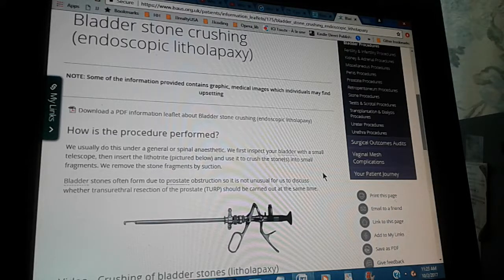Bladder stone crushing, or endoscopic litholapaxy. How is the procedure performed?